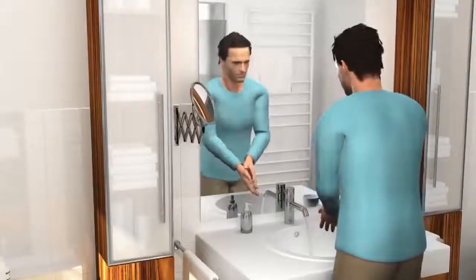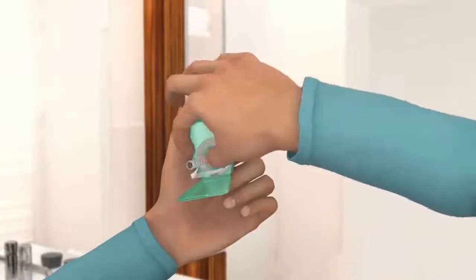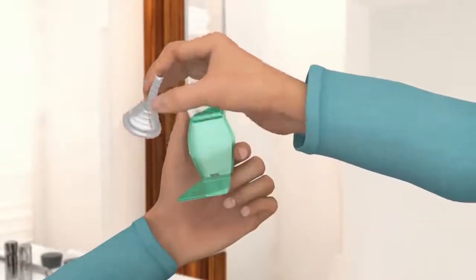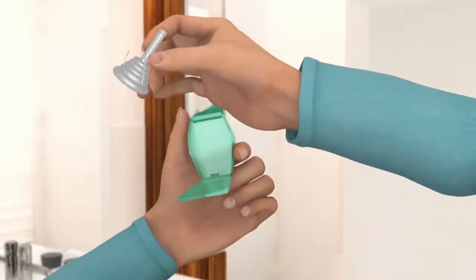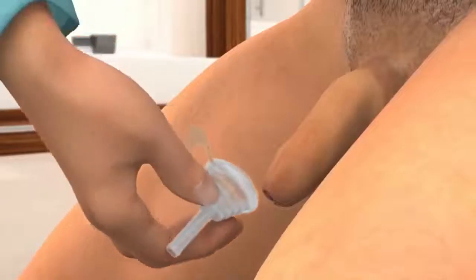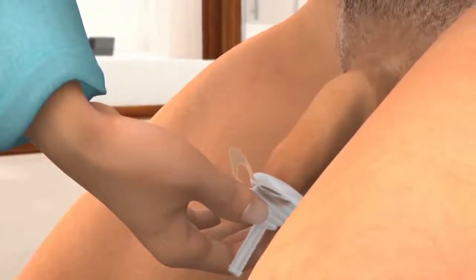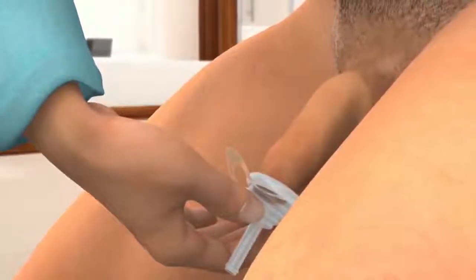Start by washing your hands thoroughly with soap and water. Open the Conveen Optima pack and remove the Urosheath. Leave the foreskin in place over the head of the penis if you are not circumcised. Now place the Urosheath over the tip of the penis, leaving a small gap between the tip of the penis and the narrow outlet tube to allow the free flow of urine.